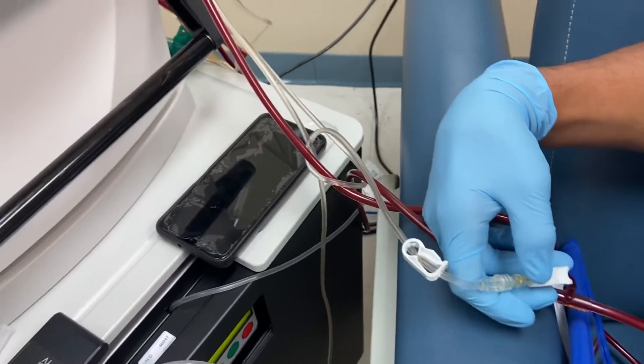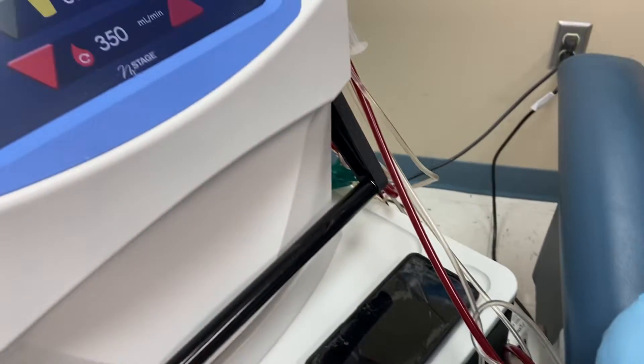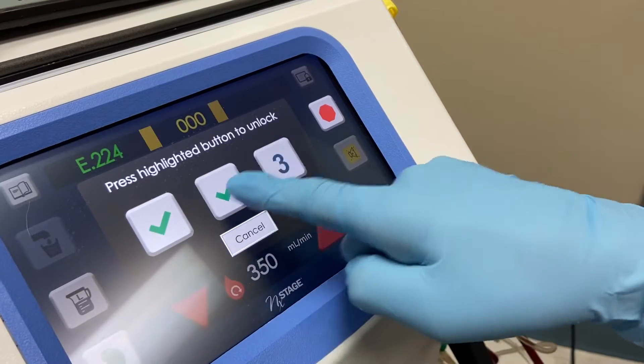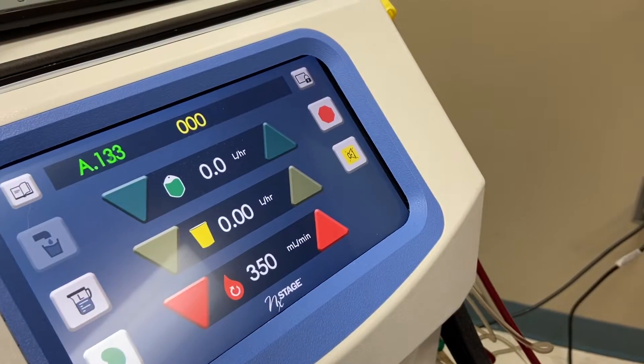Now let's stop the machine. Stop the machine, Joseph. Hit stop.